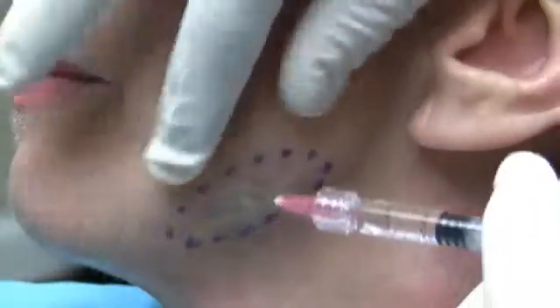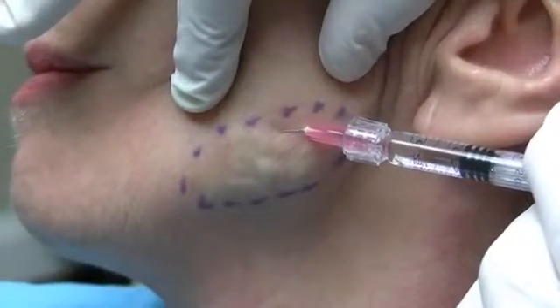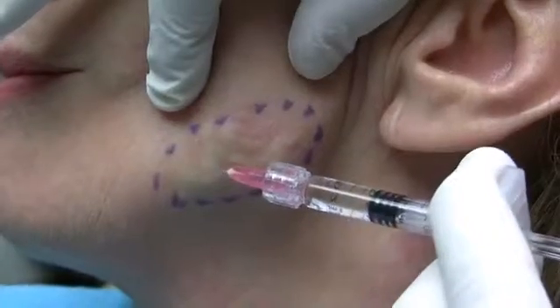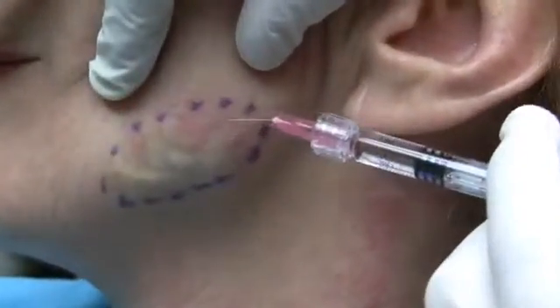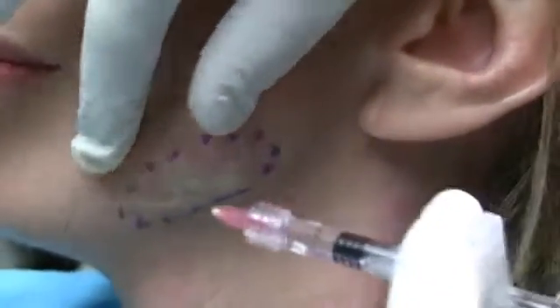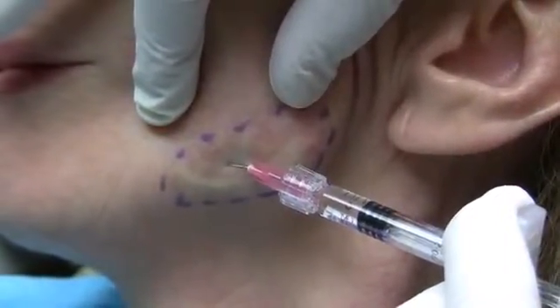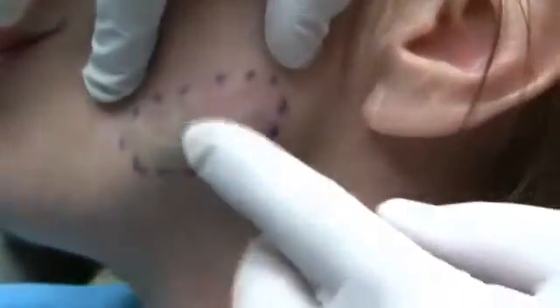So we're going to certainly layer this filler, and right now I am more in the subcutaneous plane, and it looks real bumpy to you right now for several reasons. One is that I'm putting the skin under tension, and I'm going to coalesce this with some massage in a second. And this is going to be my basal layer.